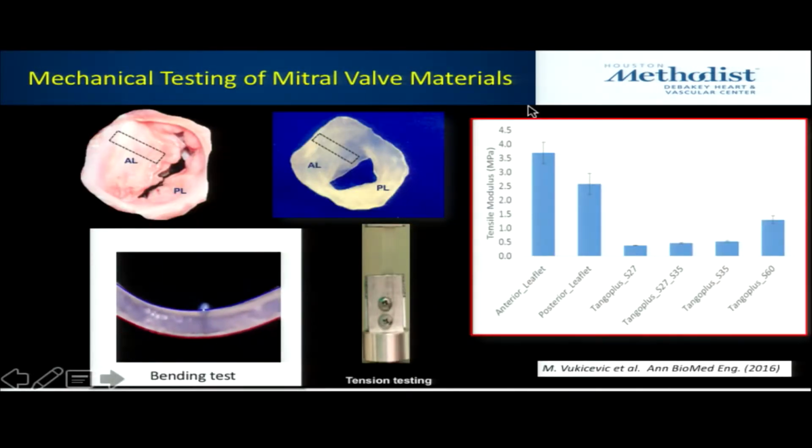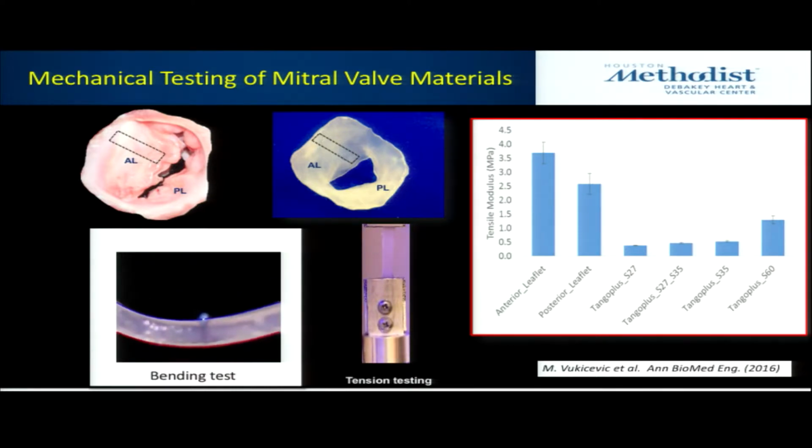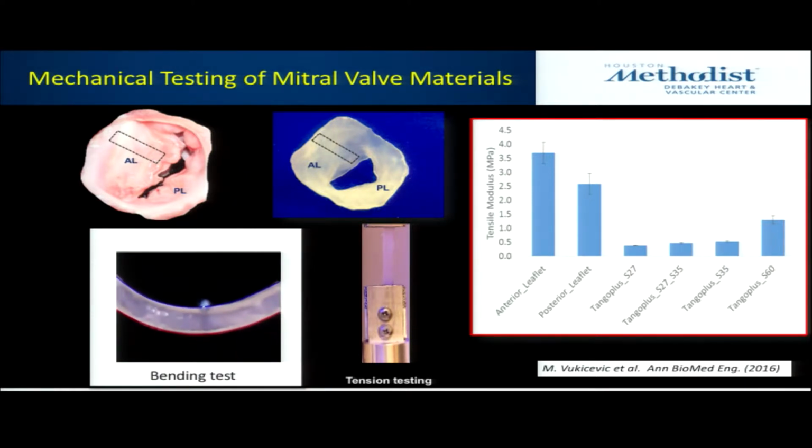And then from this material, also asking that question, well, the look isn't good enough, it has to behave ideally, at least in a soft, deformable way like real tissue does. If you want to actually do implantations with devices, you need the material to fight back the way a real tissue would in a person.